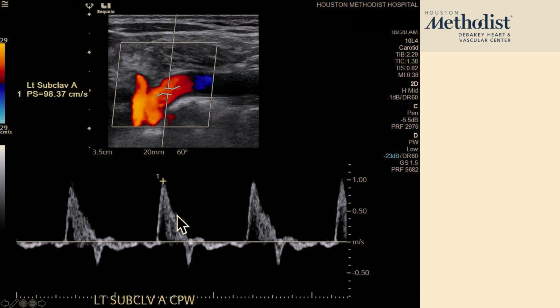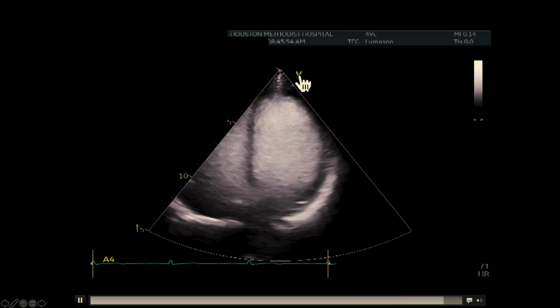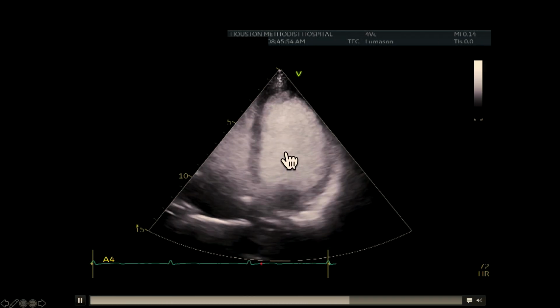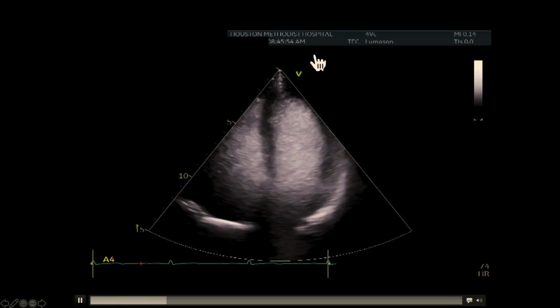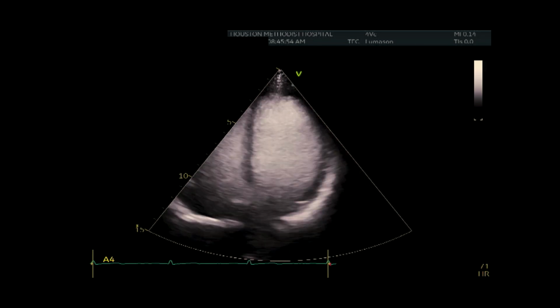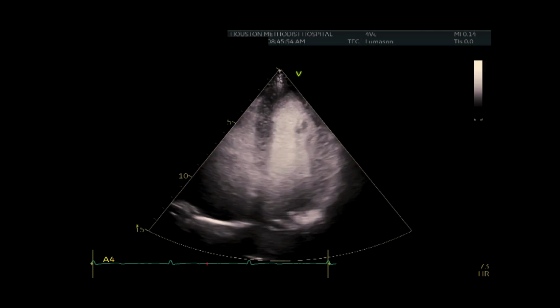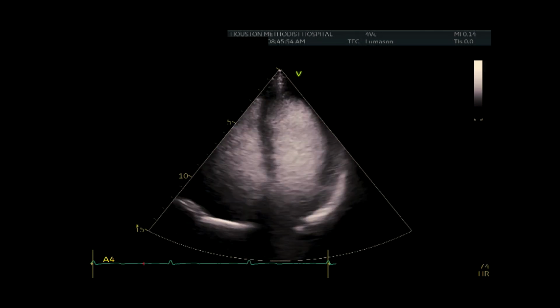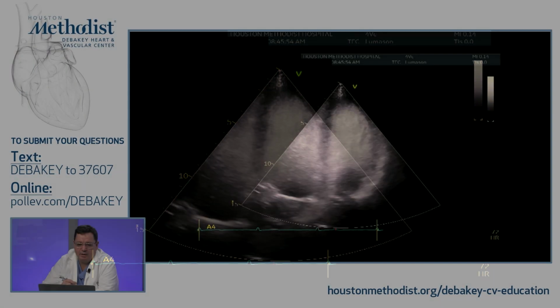So what I want you to see is the time, it's 9:20. On the same day, the patient had an echo done at 8:40, and this was the echo contrast showing, and I think the timestamp is 8:45. So it's interesting that 30 minutes later, when we started to scan the left side, all the emboli were gone, but again the contrast agent was present while we were scanning the right side.